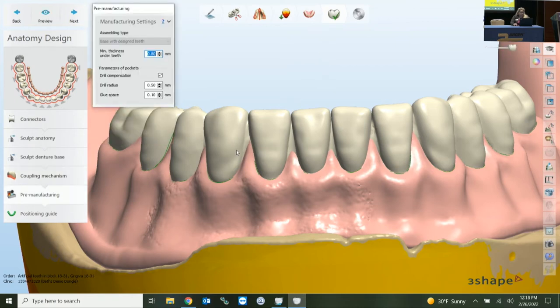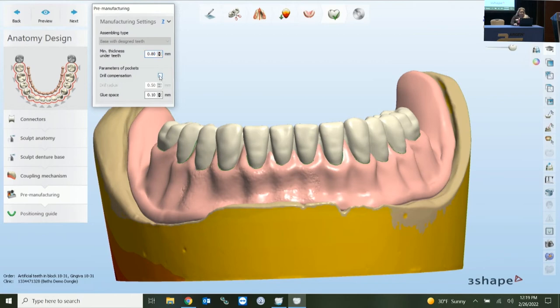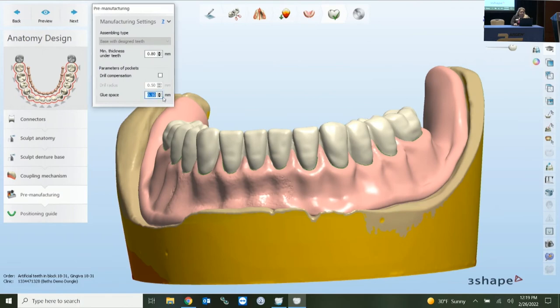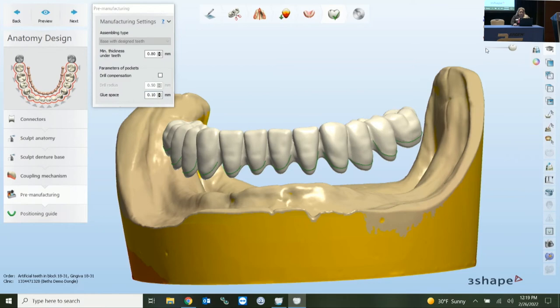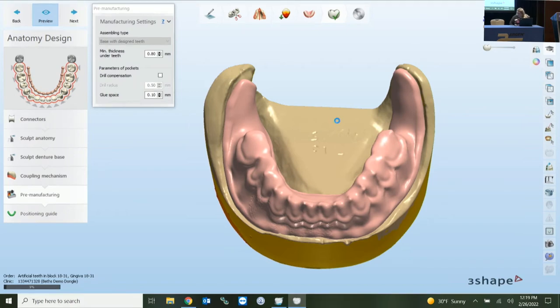In pre-manufacturing, you have information on the left for minimum thickness under teeth, and drill compensation here as well. If you're milling, you want to engage drill compensation. If you're printing, you wouldn't. You also have a glue space setting here. In the assembly step is where we're going to see our pockets generate — preview and take a look at that.